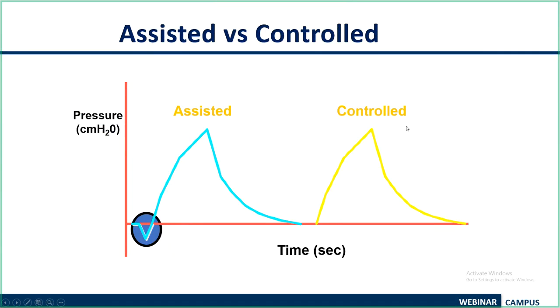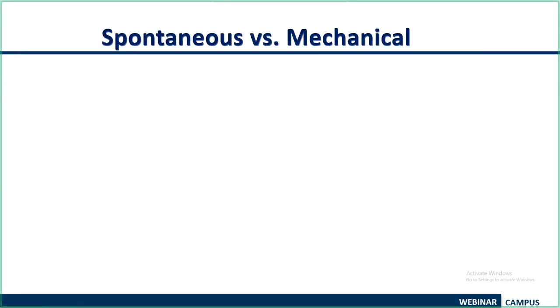I've already told you there is nothing like a pure control mode. Even though we say there are control modes, it is only theoretical now. All the modes in present day ventilators are assist control modes or spontaneous modes. So forget about the control modes.